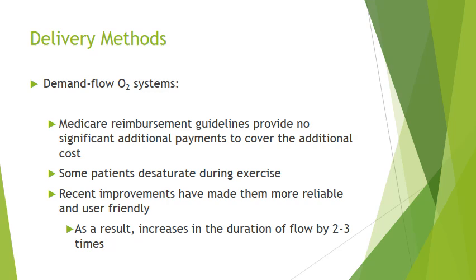However, recent improvements have made them more reliable and user-friendly. Technology has improved over time. It was not quite widely accepted or even known about several years ago, but technology is changing. They're improving how it can be used, and as a result, increases in the duration of flow by 2 to 3 times have made it more accepted throughout the community, medically, with doctors and patients. They've made modifications so you can even get more flow from it if need be.